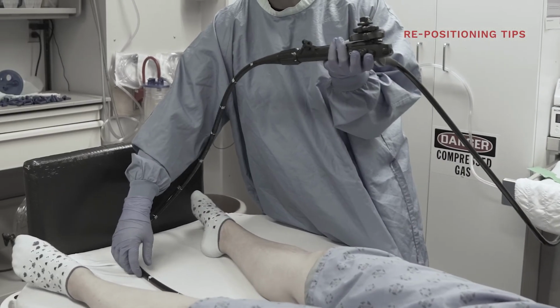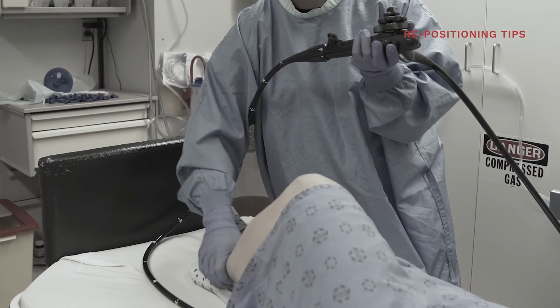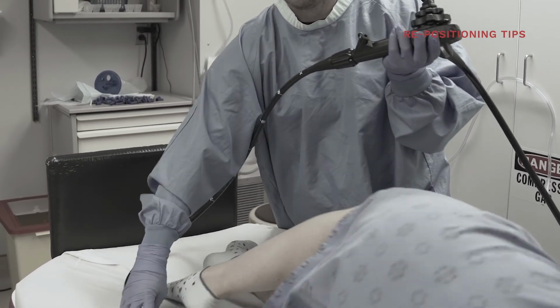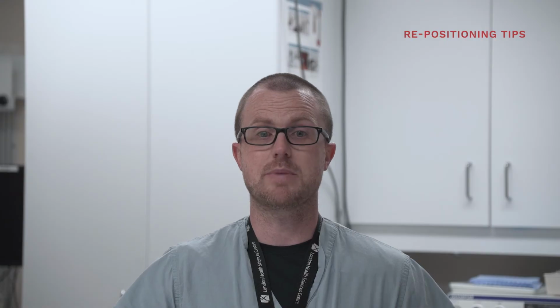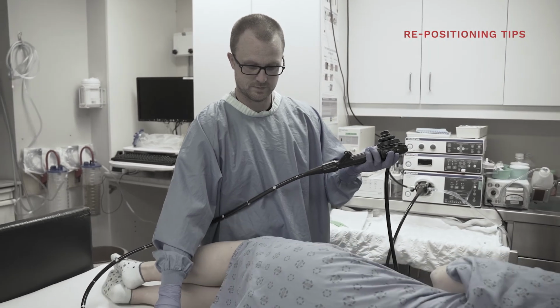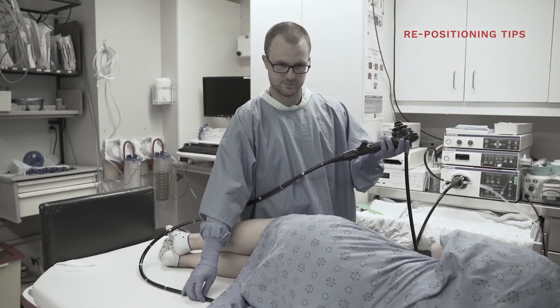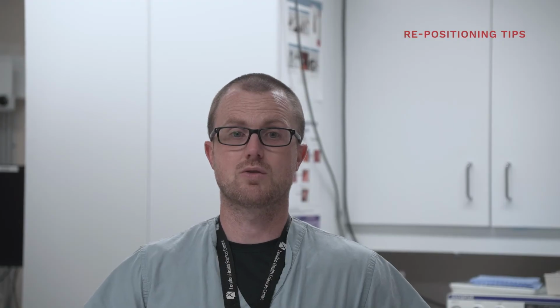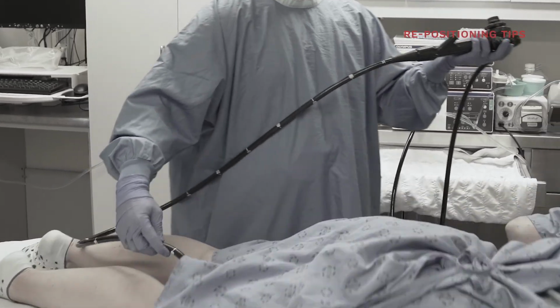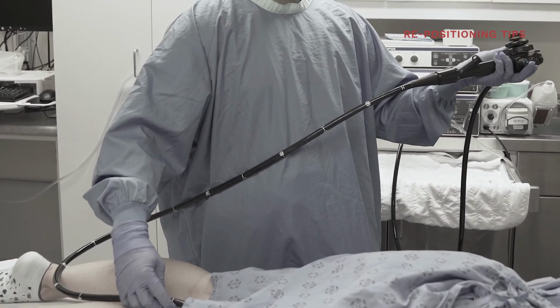This time, the scope is straightened and passed under the left leg. The patient rolls to face the endoscopist with both knees slightly bent. Keeping the patient slightly closer to the edge of the bed will prevent the endoscopist having to lean over the patient, leading to strain on the back. Finally, rotating to prone from either right lateral or left lateral decubitus is done carefully with patient instruction to remain centered on the bed, with the head tilted to one side in the recovery position.